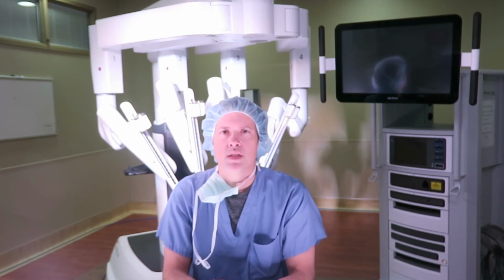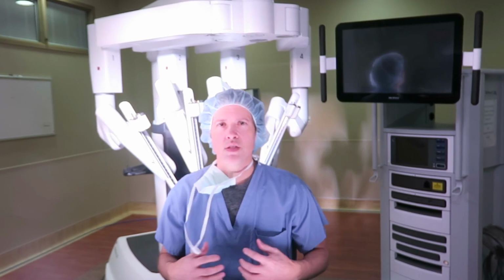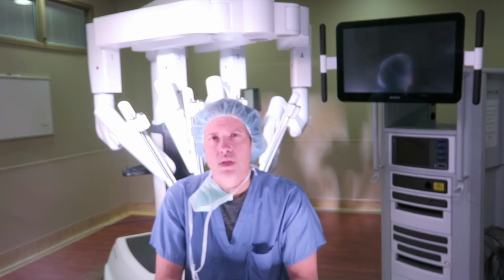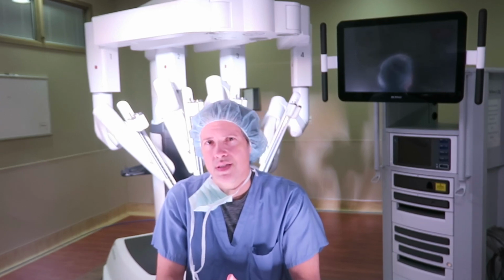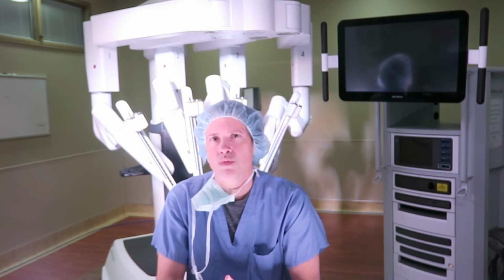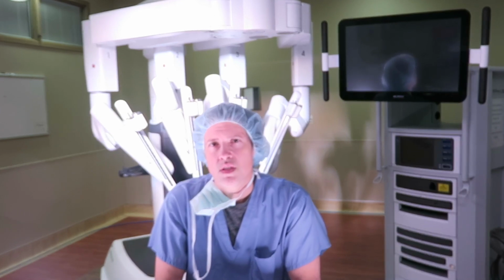The traditional way is you make a big incision through the prior scar, a lot of tissue is exposed, and then you suture a mesh in to repair that defect. That tends to have the longest stay and the longest recovery, and honestly it's the highest risk for wound problems and recurrent hernia. Many of us can do laparoscopic hernia repairs too.